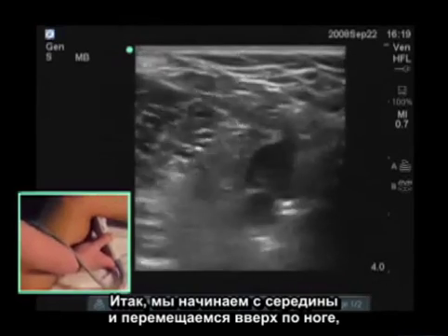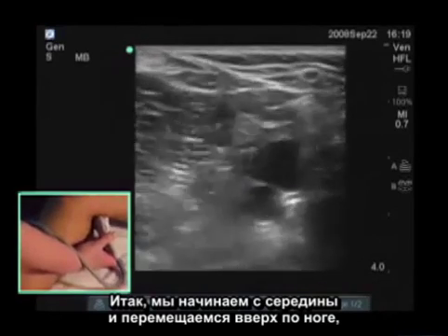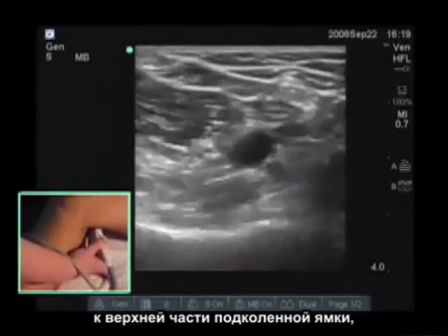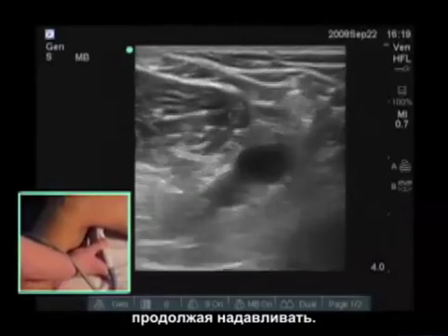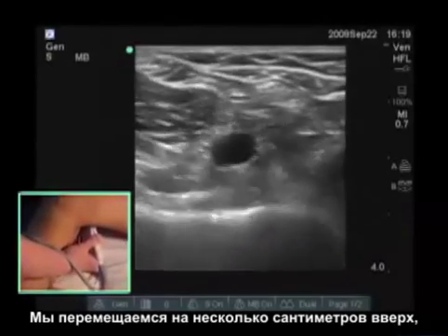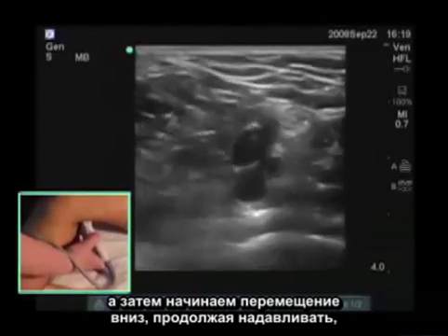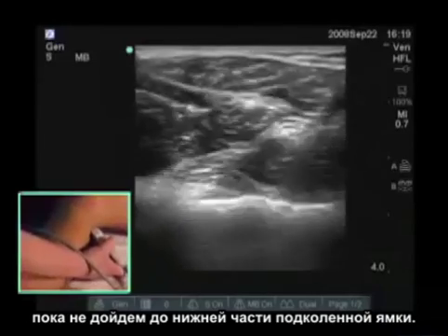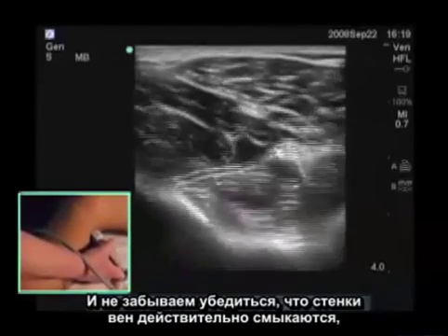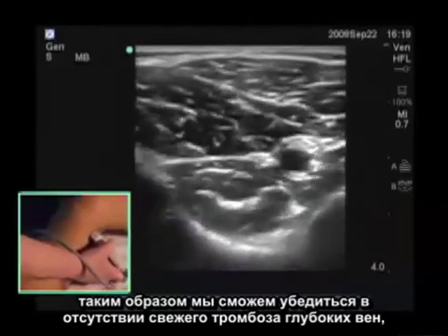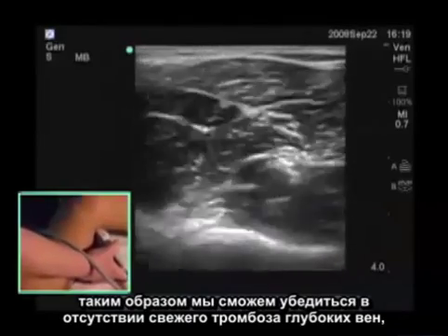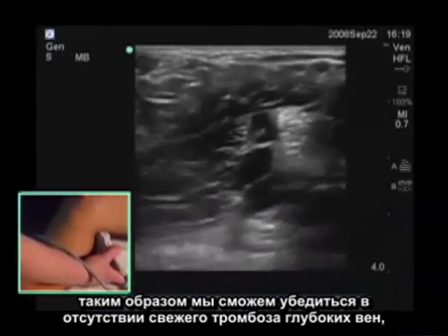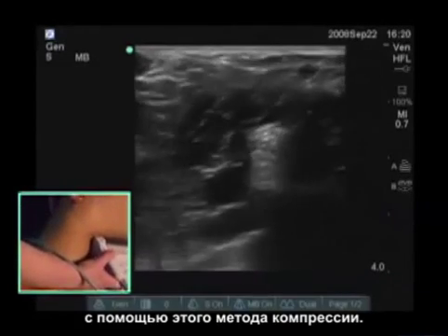We're going to start at mid-level and just work our way superiorly in the leg to the superior aspect of the popliteal fossa, compressing all the way. We go up a few centimeters, and then we start to move down the leg, compressing into the inferior aspect of the popliteal fossa. Making sure that those vein walls actually touch and meet each other so we know there's no deep vein thrombosis that's fresh, which would be high up in the popliteal fossa and difficult to see if we did not use this compression technique.